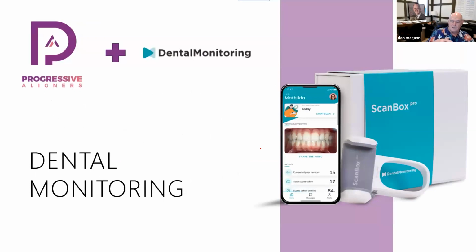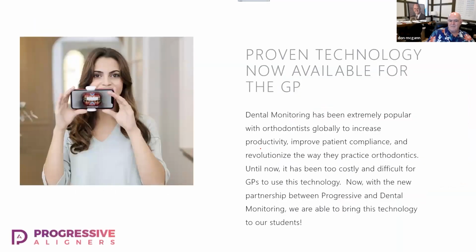But some of you may want to do dental monitoring for all of your cases and use that as a method so that the parent does not have to bring the patient into the clinic as many times. So if you're in a busy practice and you don't want to see the patients as much because you're too busy, this is for you, okay? And this is what the orthodontists have been doing to reduce the patient flow and to work fewer days in the office. So this is how they work 3 days a week or even 2 days a week, and they pile in the patients. And so they use aligners, they throw in the dental monitoring, but you can also use this for brackets. We're working on that to refine that.